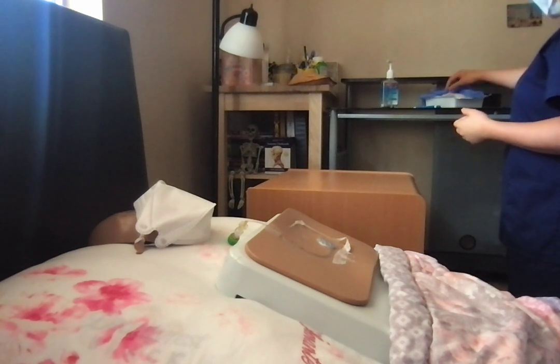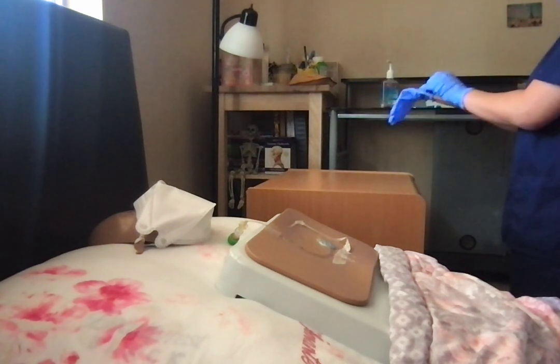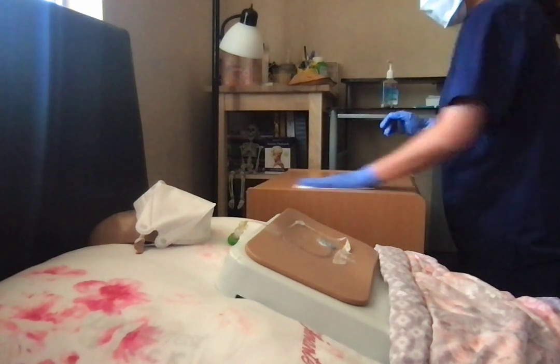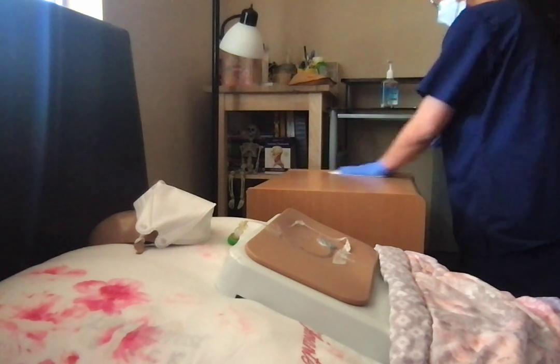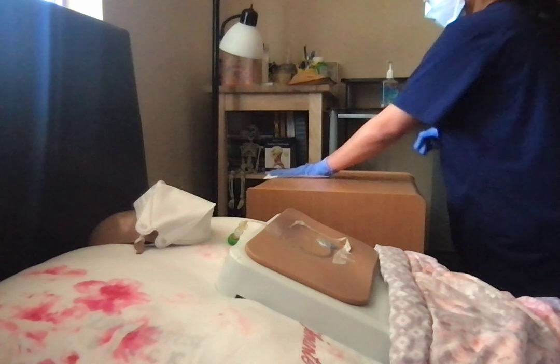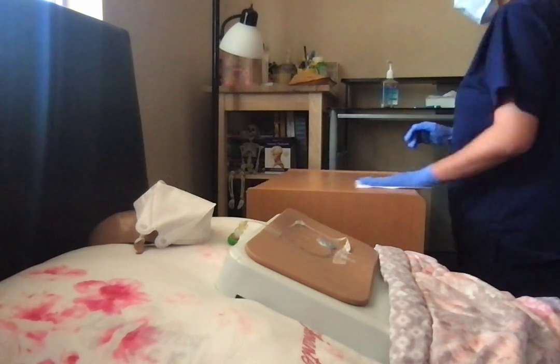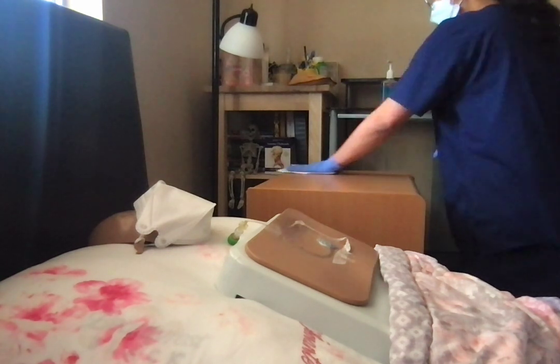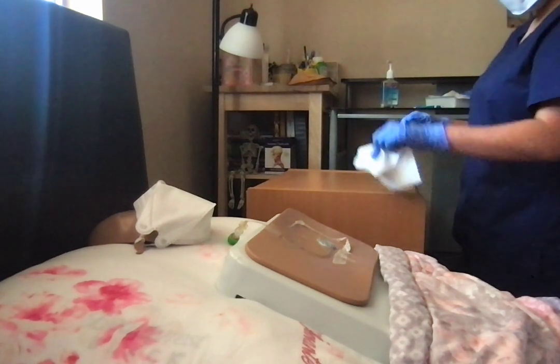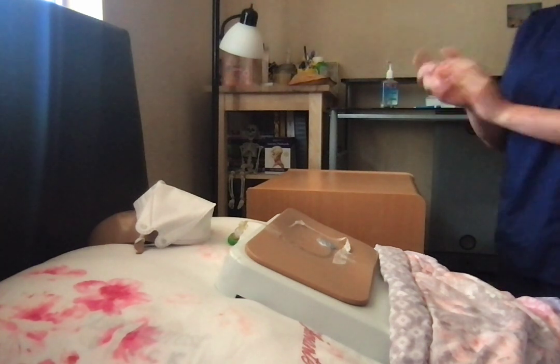I will put on my first pair of gloves. I'm going to clean my work surface with a wipe for 30 seconds, making sure to get the sides. I've cleaned the table for 30 seconds. I'm going to remove my old gloves and I'm going to let this table dry for 2 minutes.